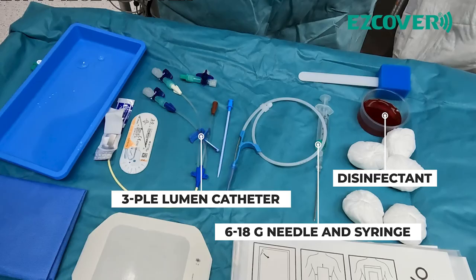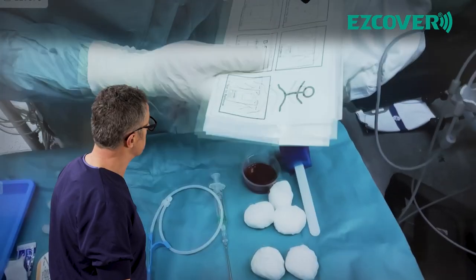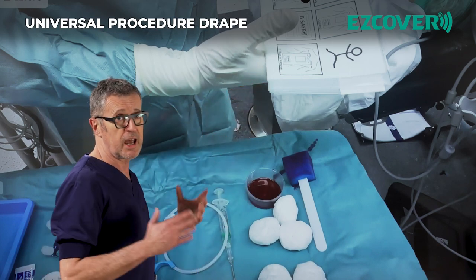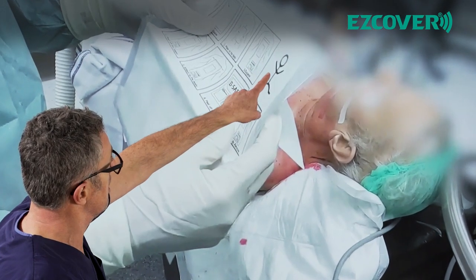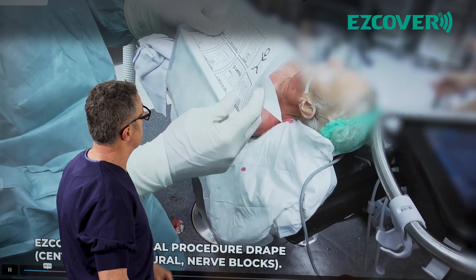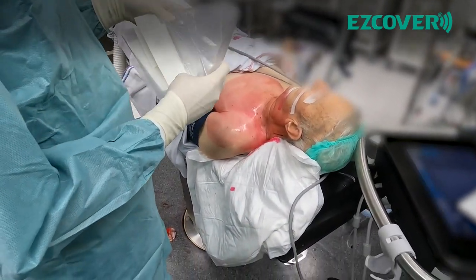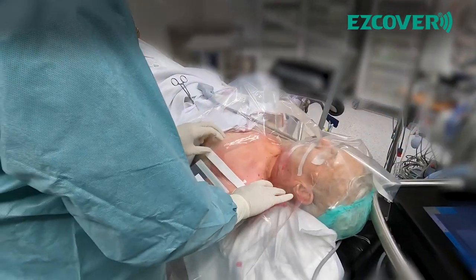So that's the equipment. You can always pause the video and watch it. We start by preparing the patient — this is a very sterile procedure so everything has to be sterile. This easy drape will replace those three separate pieces. It has a clear label indicating cranial orientation. All we do is peel off one piece that opens the fenestration through which we're going to work and position that on the patient exactly over the area of interest.